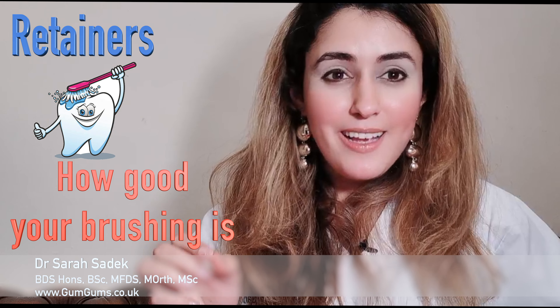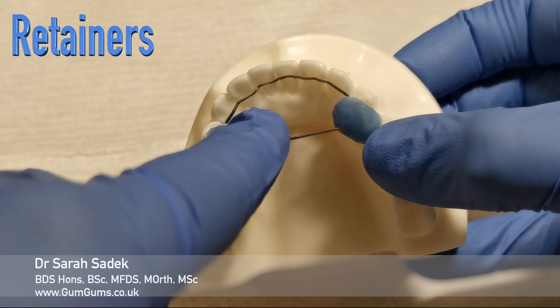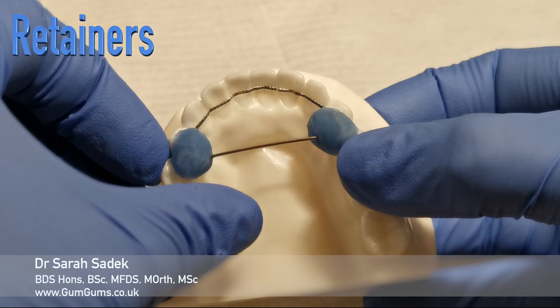Fixed retainers are made of a very thin wire, a little bit like the wire that may have linked your original brace together, and this is fitted to the back of your teeth. This is sort of what a fixed retainer looks like.